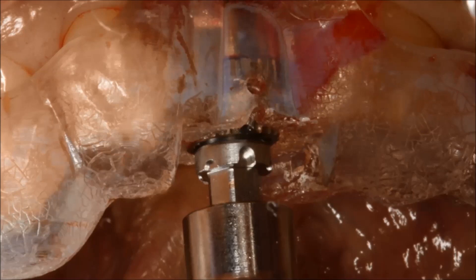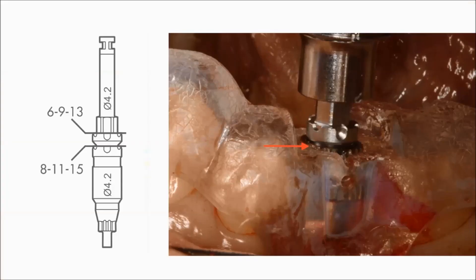It's also important to make sure that our vertical position is correct. Typically I'll seat my implant to the correct vertical position with my handpiece, then remove the handpiece, attach a torque wrench, and manually rotate that driver until the notch on the driver lines up with the notch on the surgical guide. The implant driver will have two lines that determine the vertical position of the implant. The first line is specifically for implants of either 8, 11, or 15 millimeter lengths. If I have an implant that's 6, 9, or 13 millimeters, then I would continue to seat the implant down to the second line, and that's what ensures the correct vertical position.